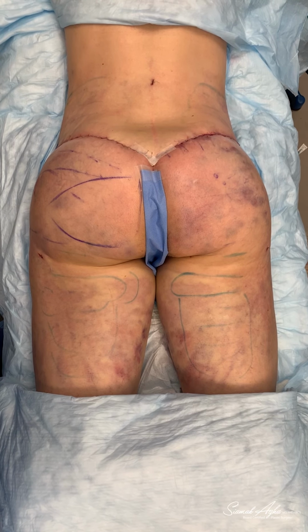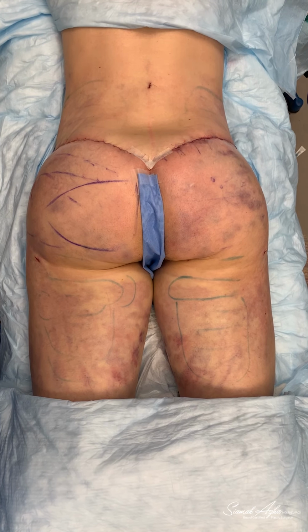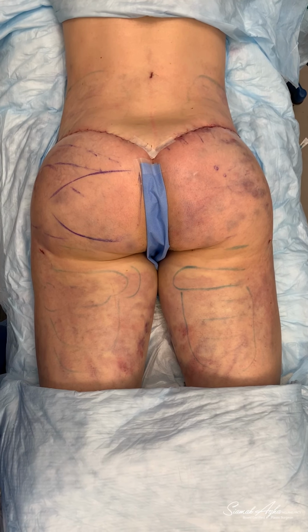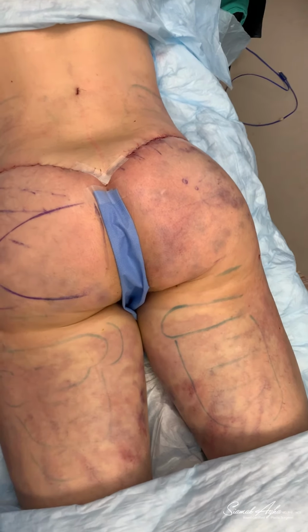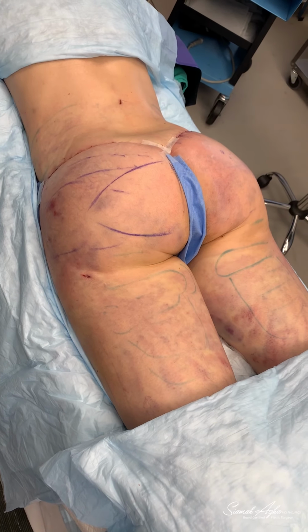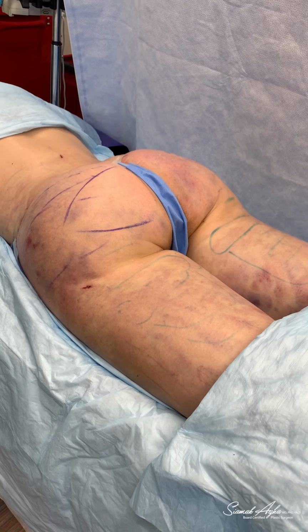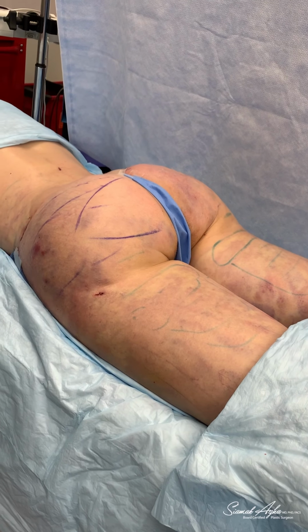I also liposhifted, which is using a power-assisted liposuction to mobilize the fat on her outer thighs and filled the outer thighs with fat. And I also made communication between the back of the thighs internally and the outer thighs so the fat can migrate and mobilize, and hopefully we can end up with one uniform fatty layer. And this is her oblique view, which is essentially the best view in the house.